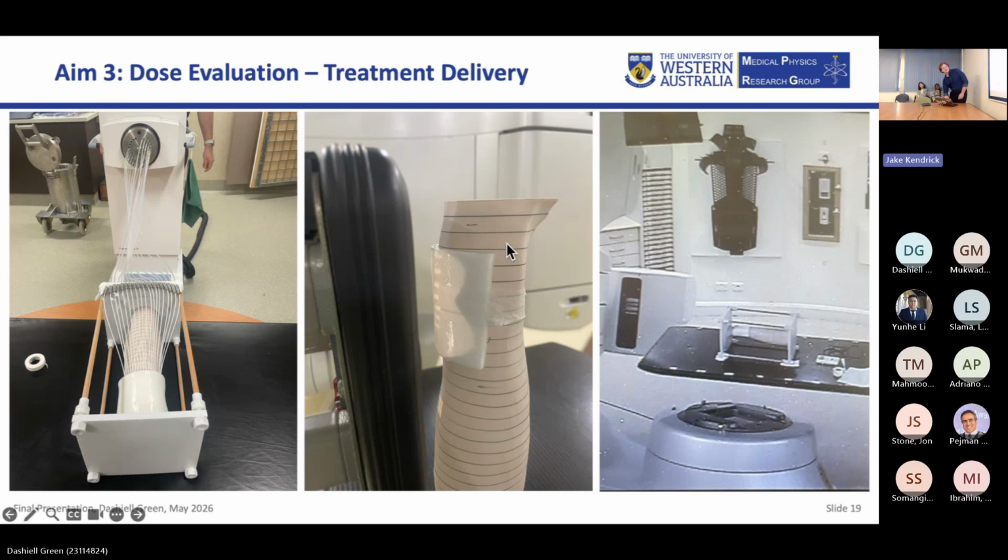So the Electron case, the film went up to this one and down to this one. So there might have been more scatter out towards these two that could have been covered by more bolus. It could have increased the dose of those out-of-field ones if less bolus was there. So it could have been increased maybe to reduce that at those points.